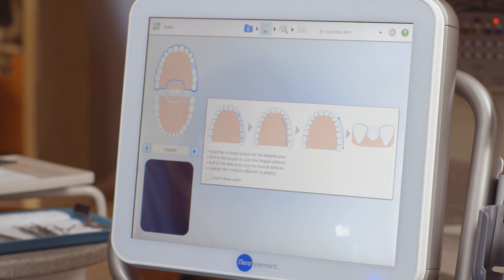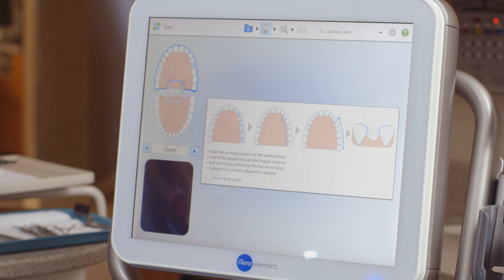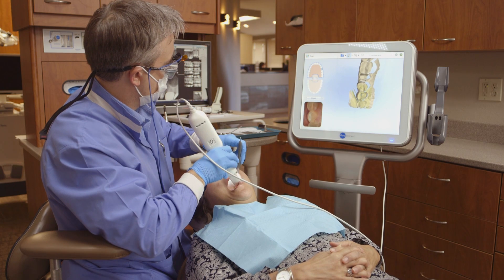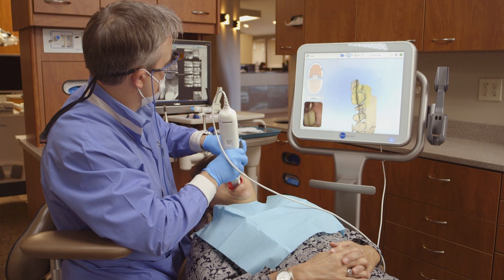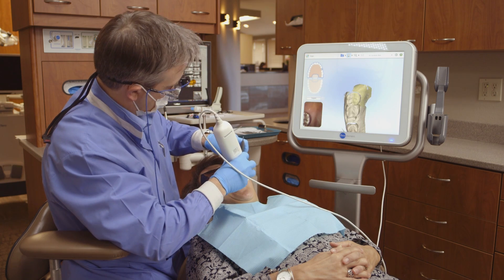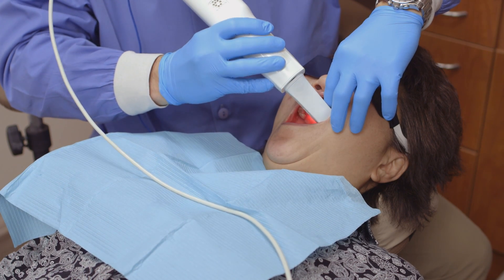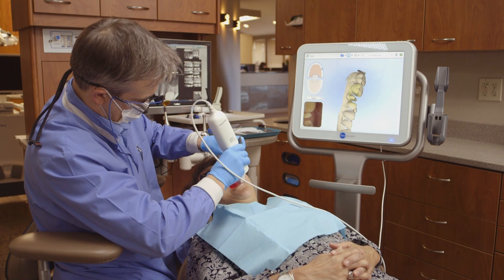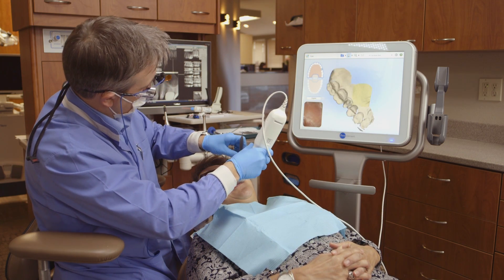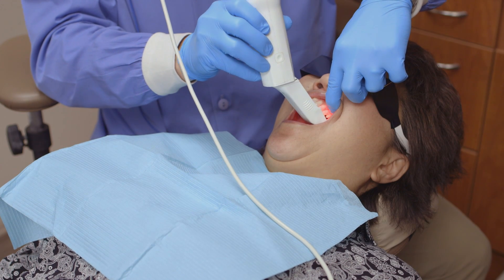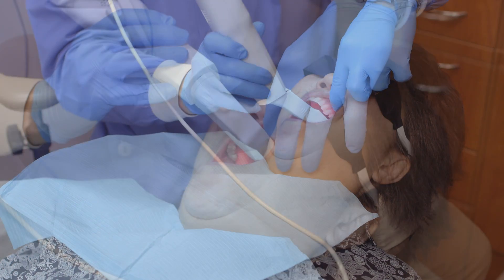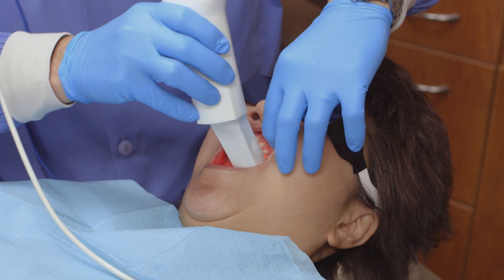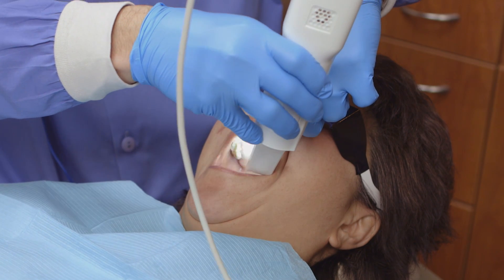Once I have captured the desired area of the prep tooth, I will follow the guidance hints to complete scanning of the prep arch. I will scan the occlusal surface for the desired area, then roll to the lingual to scan the lingual surfaces, and then roll to the buccal to scan the buccal surfaces. Next, I will capture the adjacent contacts. There are two ways to easily capture these contact surfaces. The first option is to lay the wand tip flat on the occlusal surface and angle the wand tip to capture the desired area. Alternatively, I can approach the prep from the side and rotate the wand tip to capture the desired area.